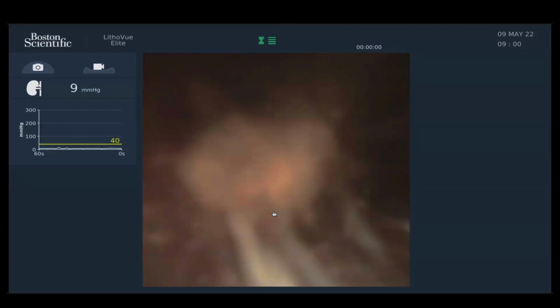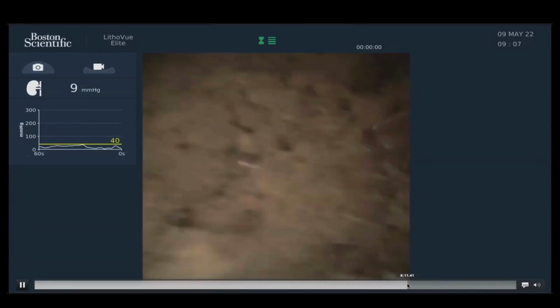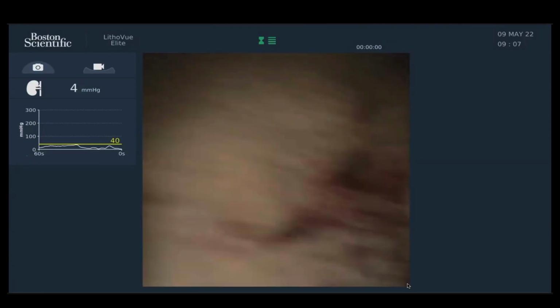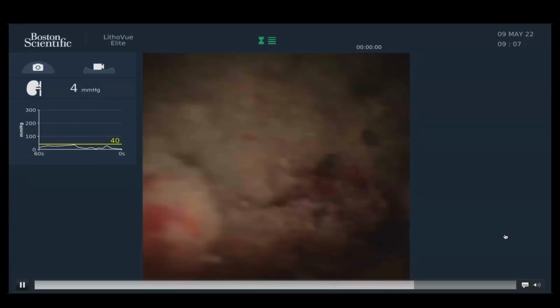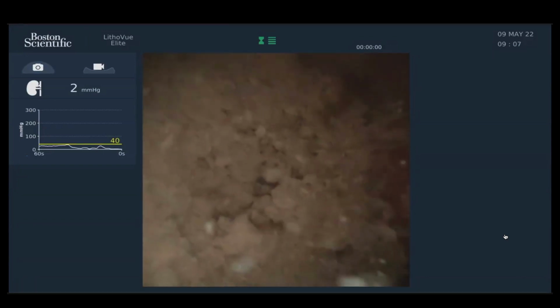And if you can forward down a little bit more, maybe Ben, you can see, throughout the case now, we're always below 30 millimeters of mercury, and that's probably too low. The truth is we don't know, but 30 is probably too low. I think 40 or 50 would be fine, but I just wanted to keep it as low as possible.